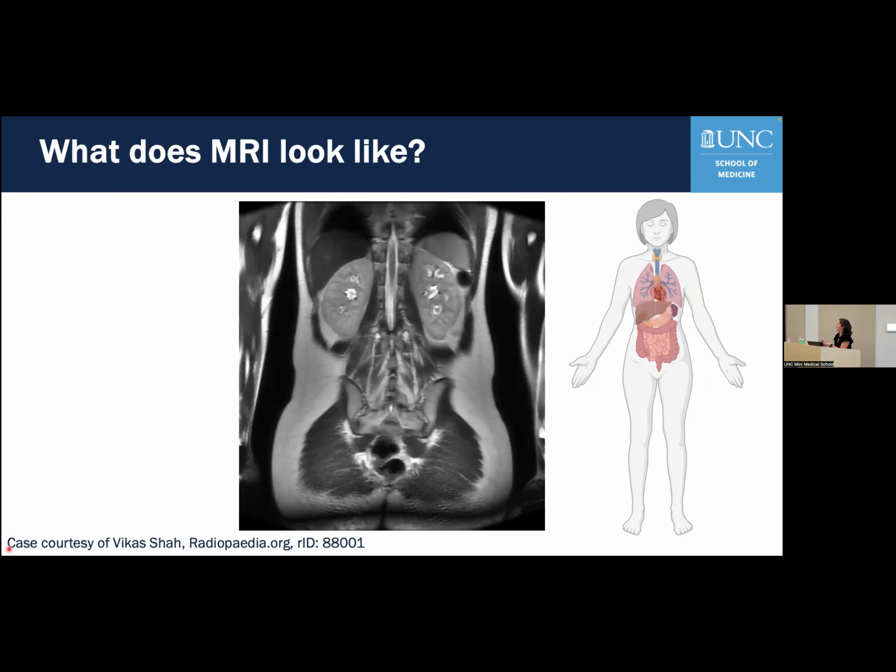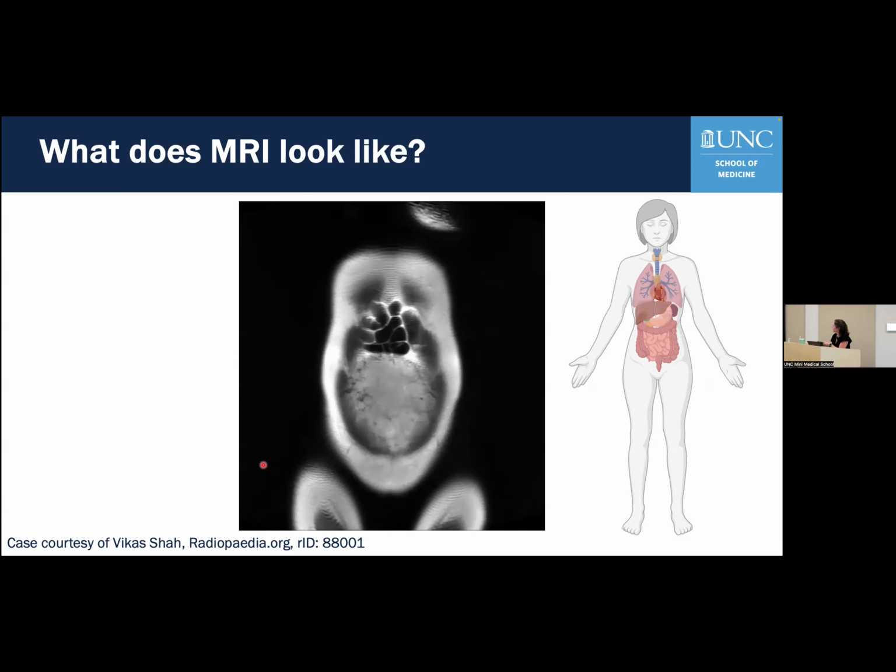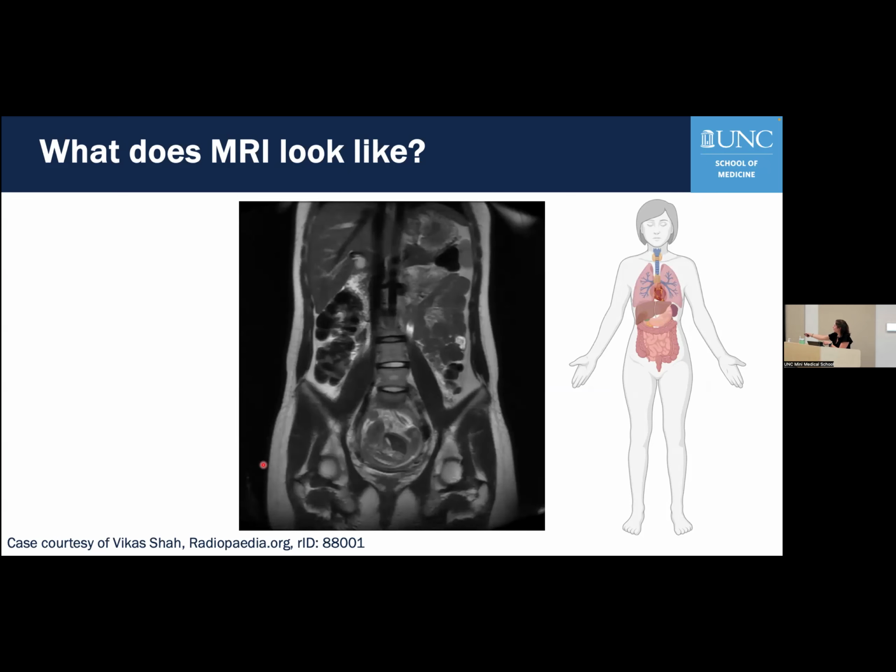If you had a very keen eye and you're looking very closely. So let me see if I can get up in here and click on it. Oh, it's not going to let me do that. Well, there's actually a baby in there, in that MRI. So maybe you're not a radiologist yet, but that's one really great thing about MRI, because it doesn't use radiation. It's a really great imaging technique to use in pregnancy. Let's see. There we go. Do you see the baby right in there?